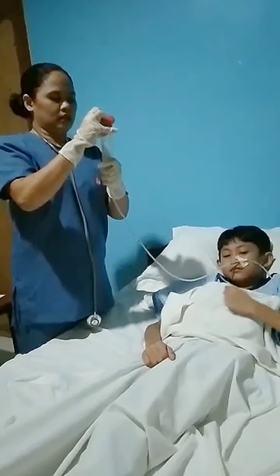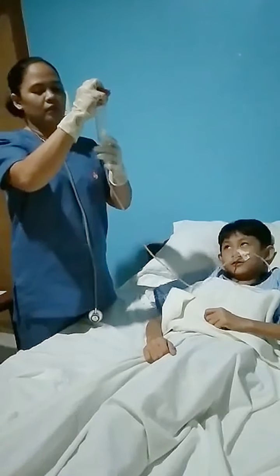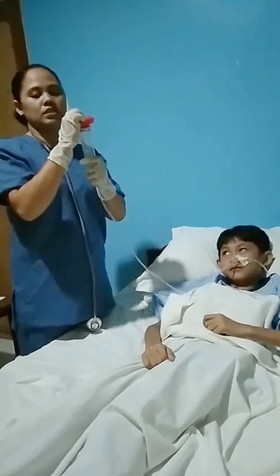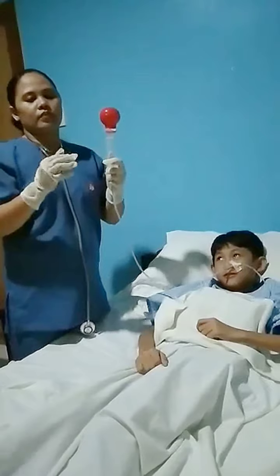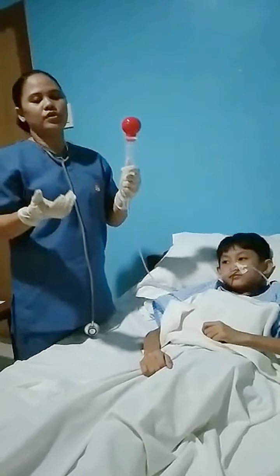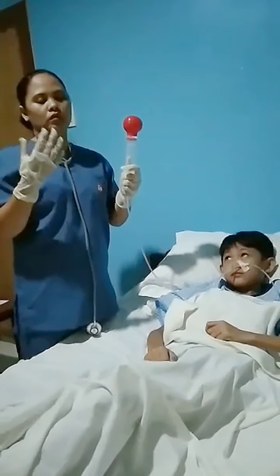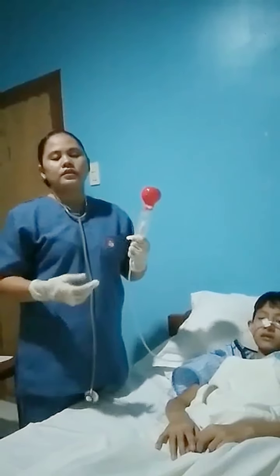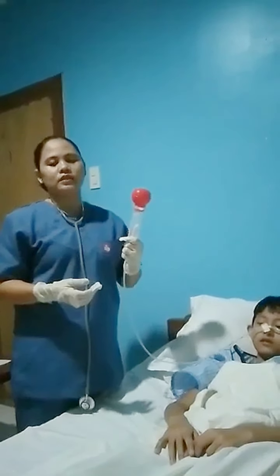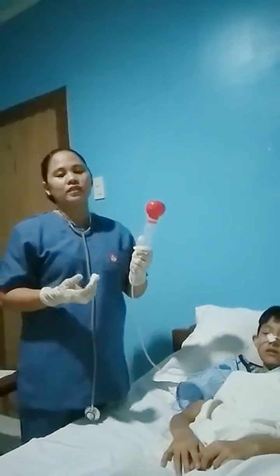And let go of the kink. And release the cover. As you release the cover, you should be able to see some of the gastric content being sucked or pulled inside the aseptic syringe. Now that we have the aspirated content inside the aseptic syringe, we can now check the pH level.